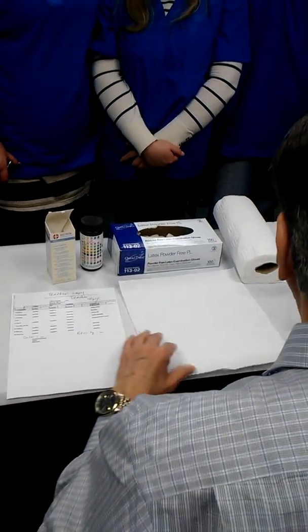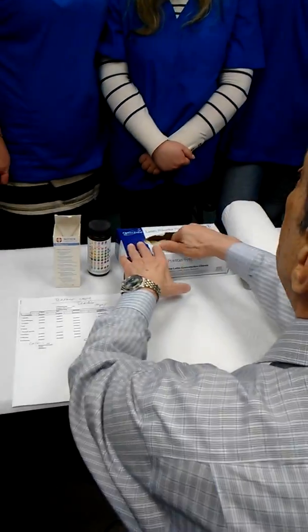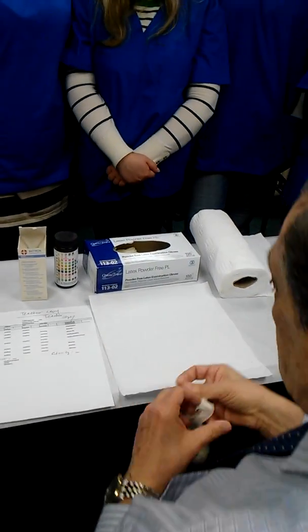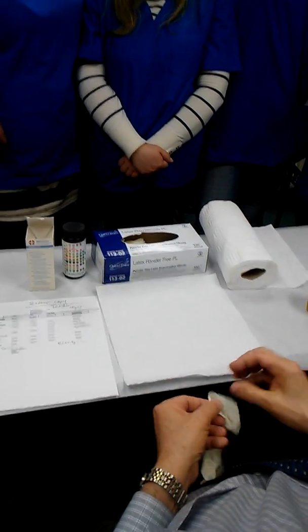So first of all, you have to wash your hands and apply gloves, right? And then we're doing the test, right?